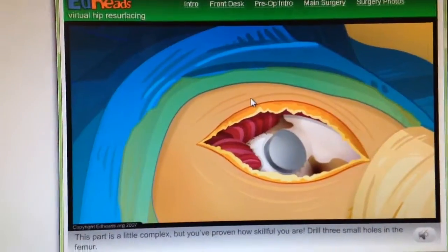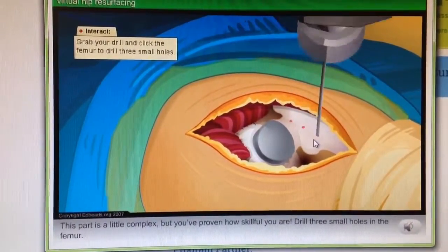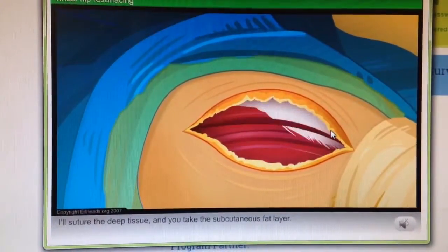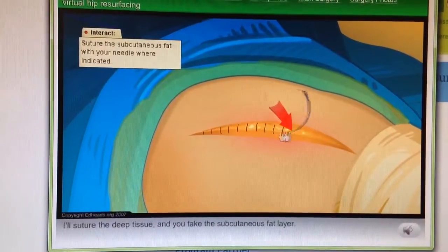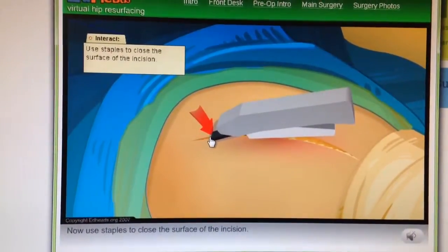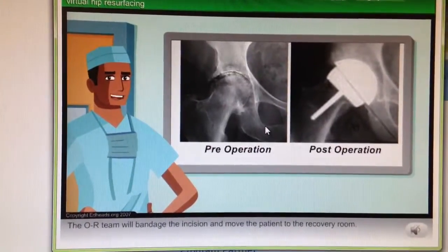Time to close! This part is a little complex, but you've proven how skillful you are. Drill three small holes in the femur. Let's suture the hip capsule to the holes you just drilled. I'll suture the deep tissue and you take the subcutaneous fat layer. Now use staples to close the surface of the incision. Your technique? Flawless. Why couldn't we use sutures?